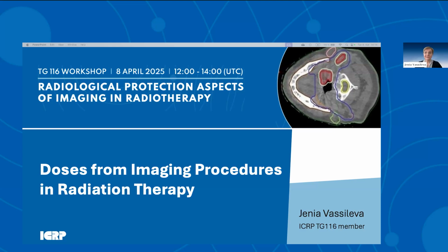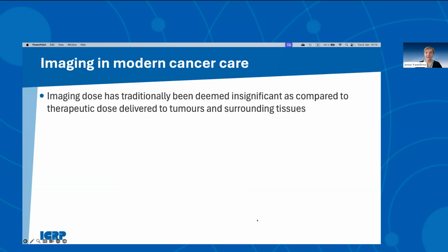I'll briefly summarize the information from the literature review on doses from imaging procedures in radiation therapy, and not only during therapy, but also try to put in perspective the whole journey a cancer patient has with imaging. So imaging dose has been traditionally deemed insignificant as compared to therapeutic dose delivered to tumors and surrounding tissues.